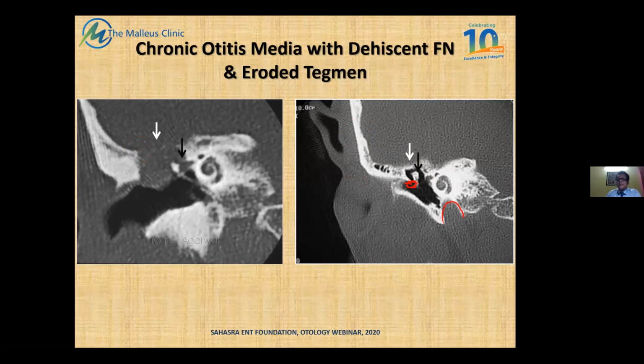The vertical part of the internal carotid artery. Now you might say, sir, here too the bone is missing. Yes. We do know that even in spite of the patient not harboring a cholesteatoma, even sometimes during a normal tympanoplasty or a stapedotomy, we do find that the tympanic segment of the facial nerve is dehiscent.